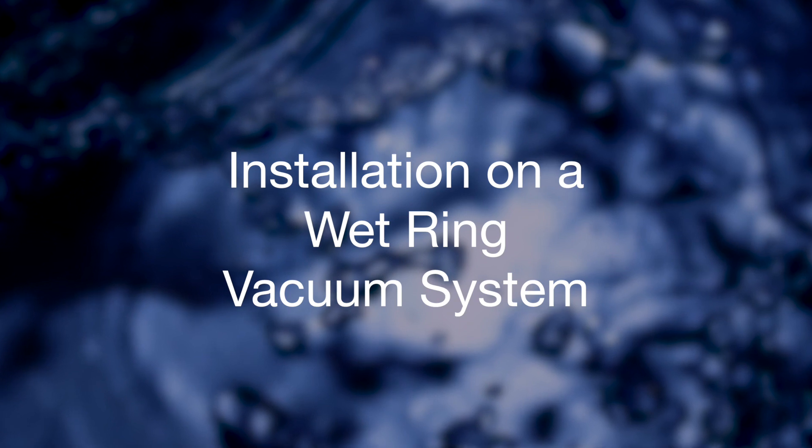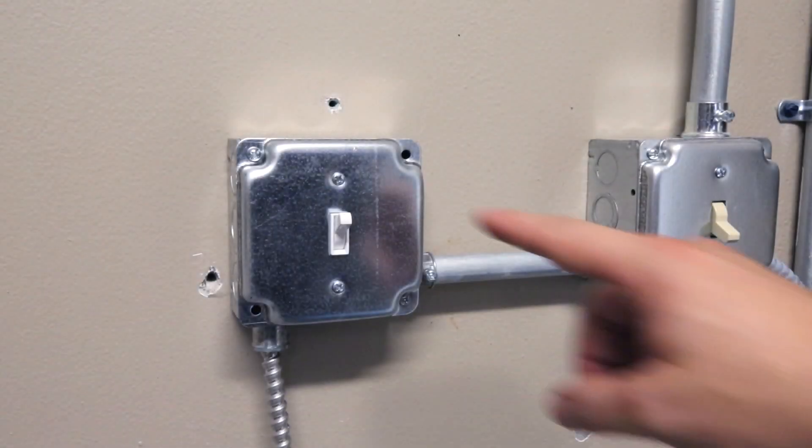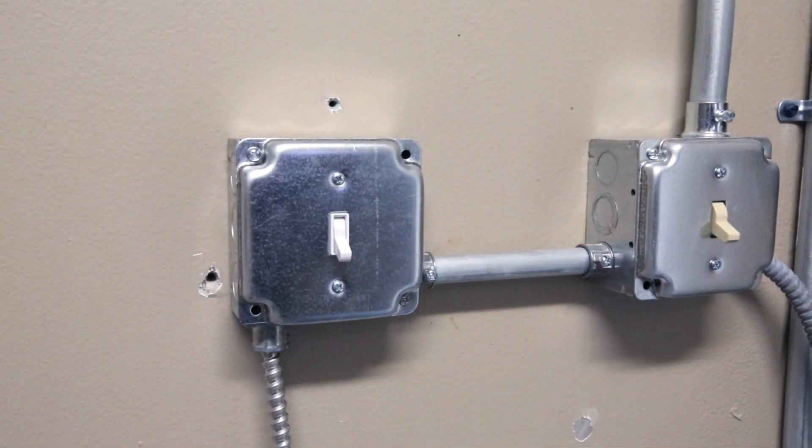For this video, we will be showing Eco2 installation instructions specifically on a wet ring vacuum system. To begin the actual installation, start by turning off your vacuum pump.